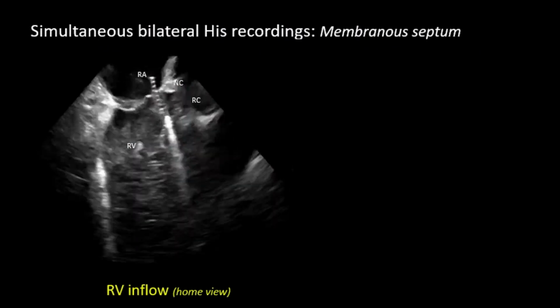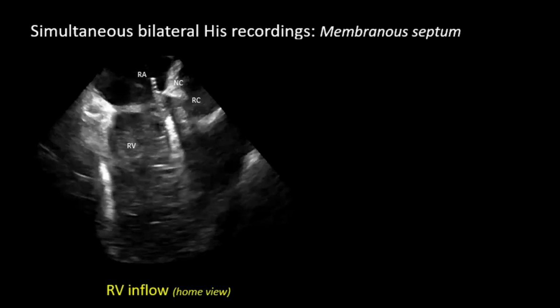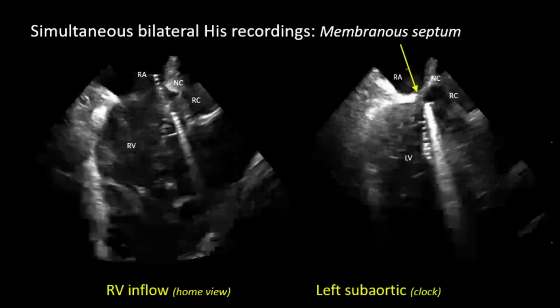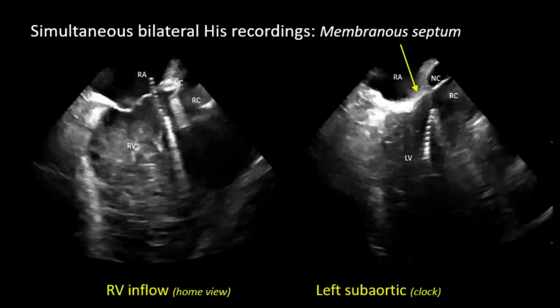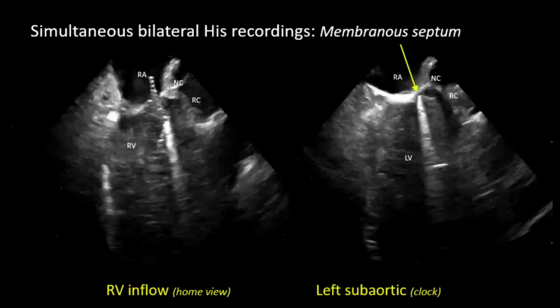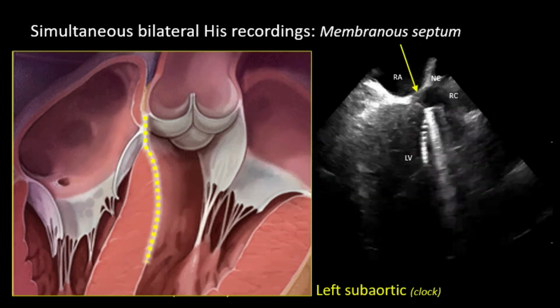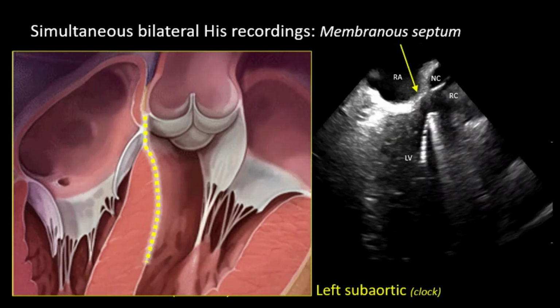Here's an example of an intracardiac image in which we have a multi-electrode catheter here on the right side of the septum. And here's another catheter being shown on the left side. So what we're interested in here is the left septal recordings. And we felt that this could give us the answer with respect to the mechanism of left bundle branch block.